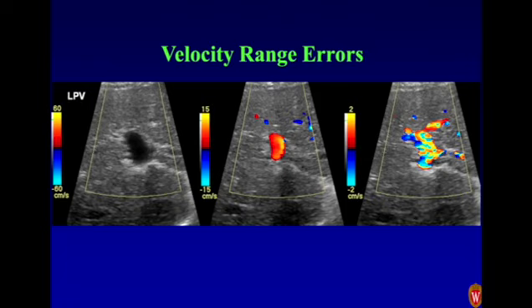So here's the portal vein, very simply seen. When I took the pulse repetition frequency and set it to 60, it's too high. All right, I don't see any flow in here on color. Why? Because the flow is being suppressed. The color is being suppressed by the wall filter. So see that little black area between the two directions? It blocks out the painting of color in an area, and so no flow is seen here.